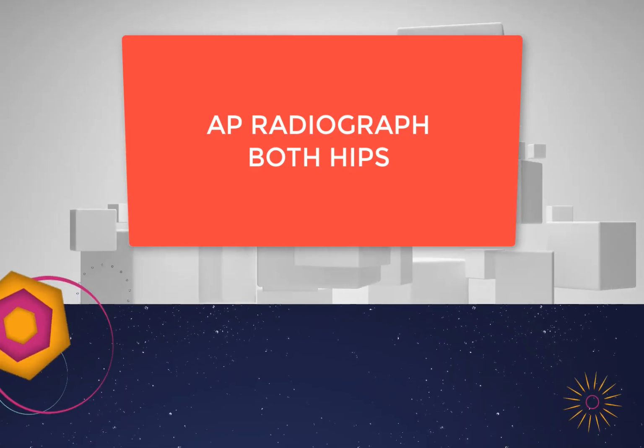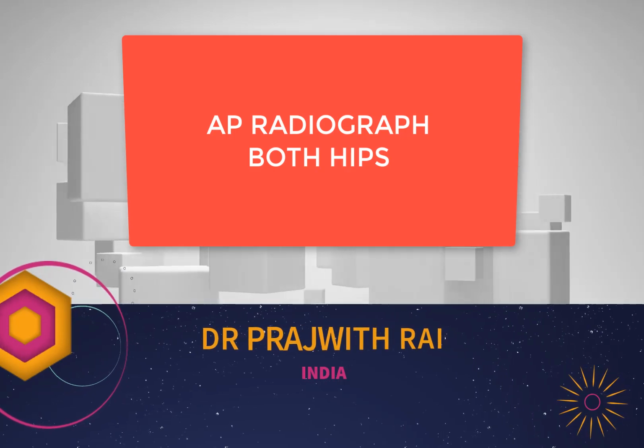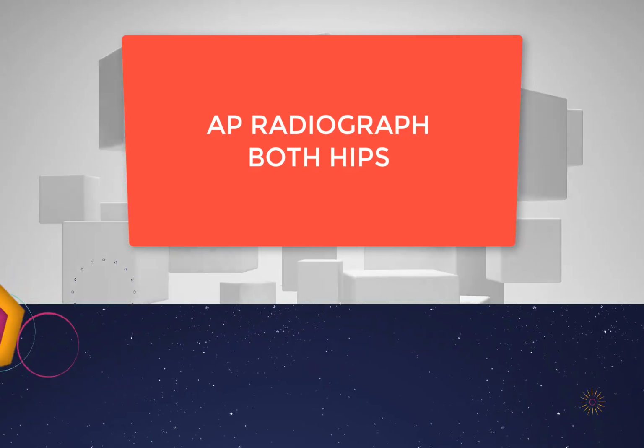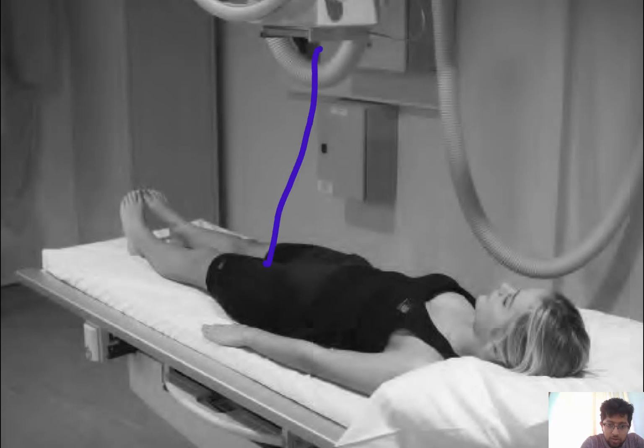When we do an AP radiograph of the pelvis, we pass the radiation. The X-ray starts coming from anteriorly, goes posteriorly to the cassette that is kept in the posterior aspect. The first thing that we have to understand is the positioning that we do in an AP radiograph of the pelvis. As the centering is usually done at the midpoint, the rays that are coming to the hip joint are the divergent rays.